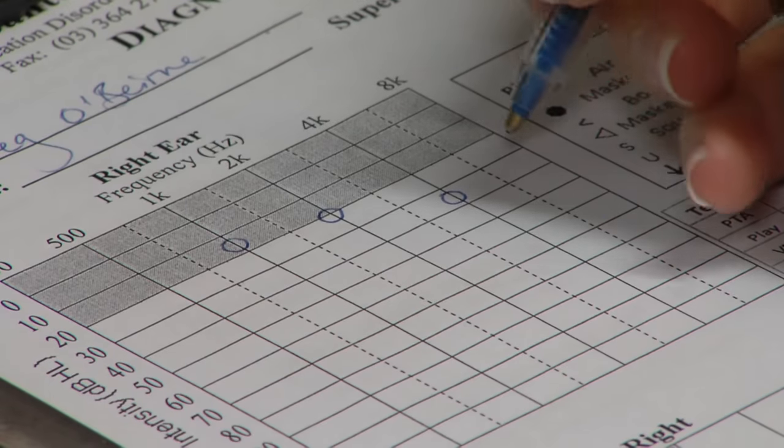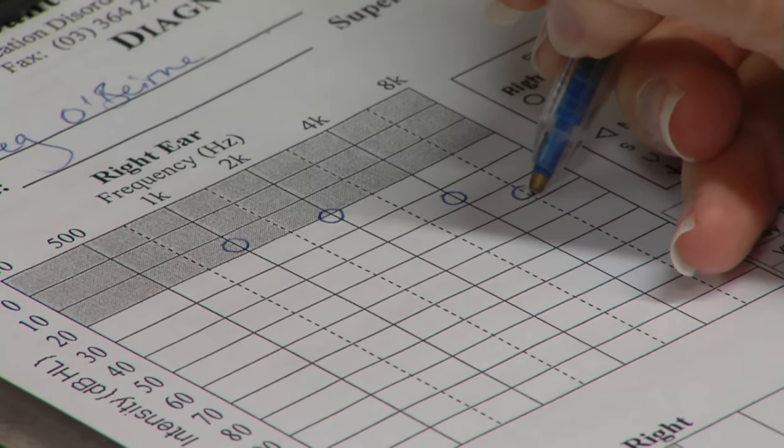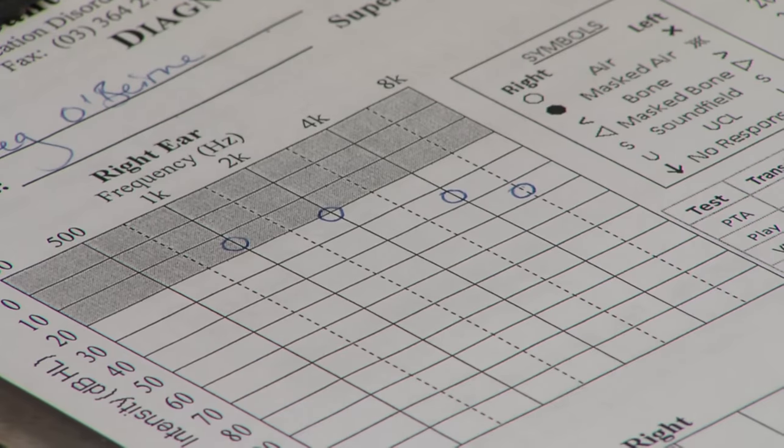Once testing is complete, the audiologist integrates the data across each of the different tests and presents the findings to the client. That was great, Greg, so we're finished there. So just showing you the results — there's two graphs here, for the right ear and the left ear, and they're showing graphs of your hearing levels. If necessary, the audiologist may provide some counselling on hearing or balance difficulties and make recommendations regarding rehabilitation or further assessments.